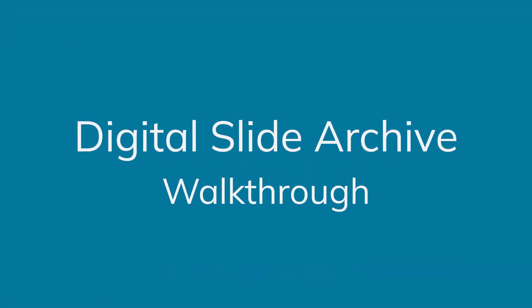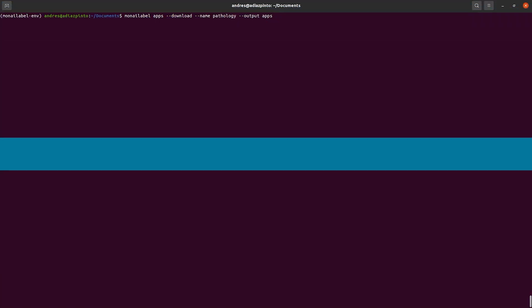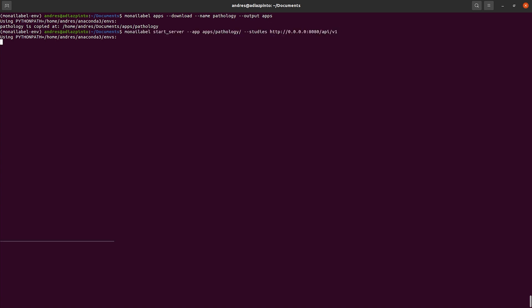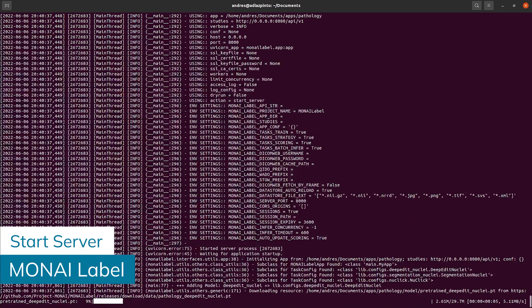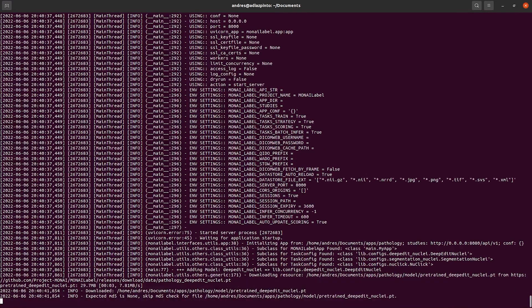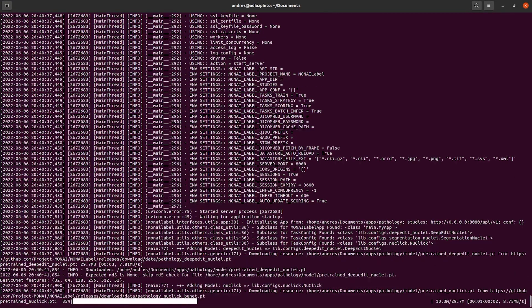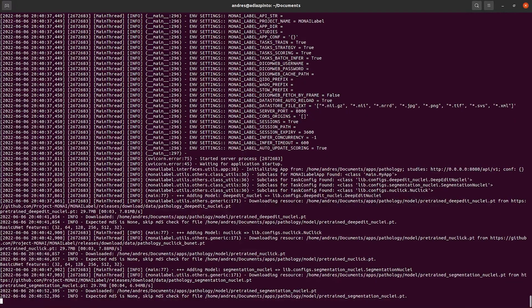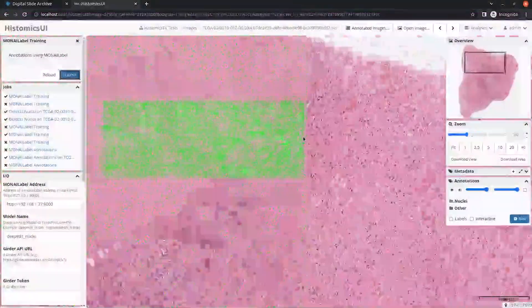We'll walk through a quick example using the Digital Slide Archive viewer and the DeepEdit Nuclei model. First, you'll need to install DSA. You'll then install MoniLabel using PIP, and then you can use the MoniLabel CLI tool to download the pathology sample applications quickly. You'll start the MoniLabel server, which downloads and loads the DeepEdit Nuclei Segmentation model automatically. You're then ready to load the MoniLabel application within DSA.